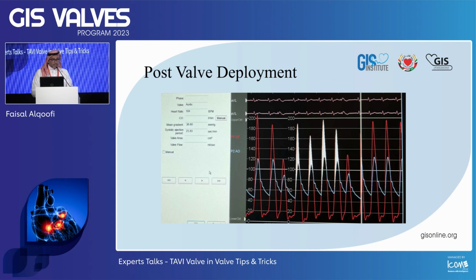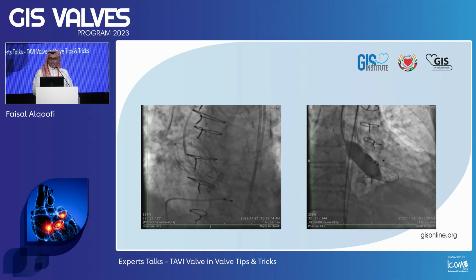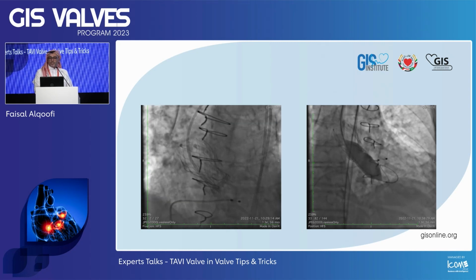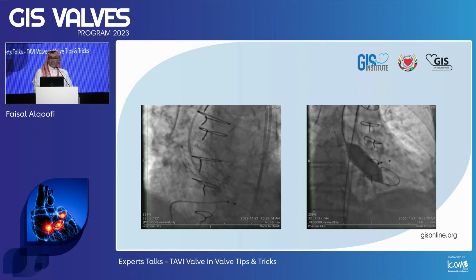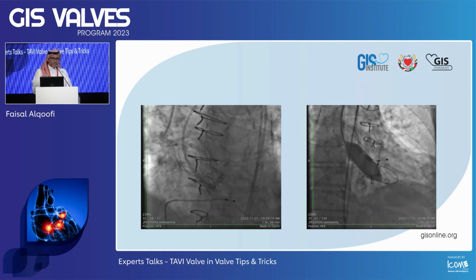So the decision to fracture was mainly based on the hemodynamics, and the thought process should always be, is the Evolut valve fully deployed, or am I just dealing with a constraint in the valve? So we decided to fracture, and again, be patient, because that's what happened with us. I will show you the fracture setting, but in general, towards the end, you could see the full balloon, and I tried to take maximum cine to see the true fracture. Honestly, I could not see it.